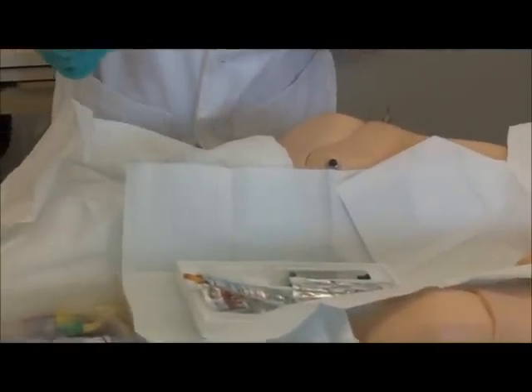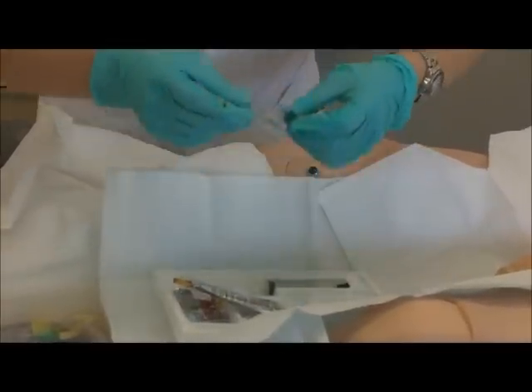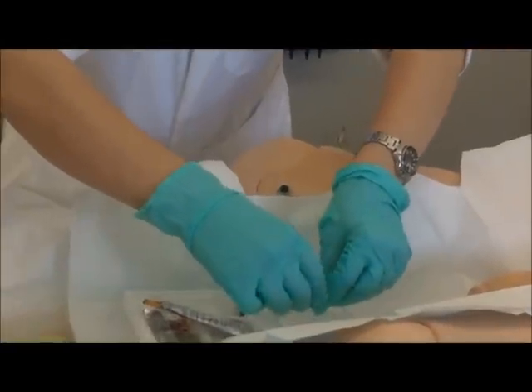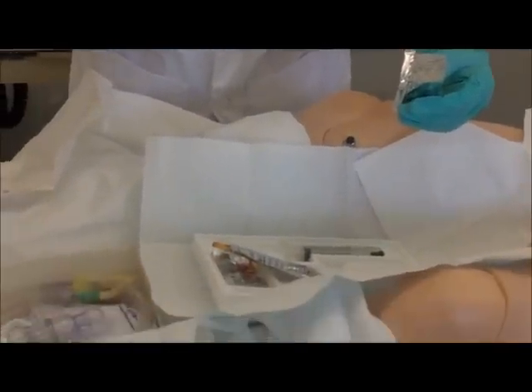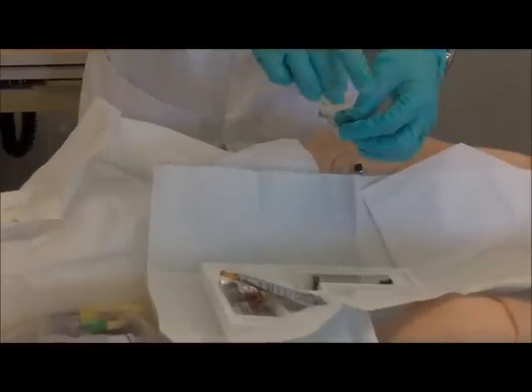Next you're going to open up your lubricant. And you're going to squeeze it out on part of the plastic, right here. Squeeze. Some of the kits have another tube with a lubricant in it — I believe it has a green casing to it. So that's your lubricant.